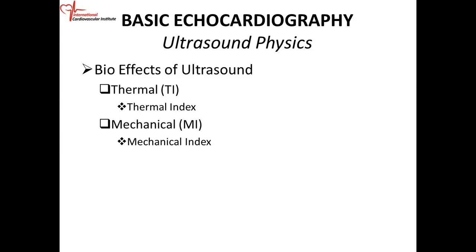That deals with heat production. And then when you say MI, it's mechanical index. It's the ability to form cavities. So the ultrasound can form cavities. And as a result of that, it can form bubbles, or it can burst bubbles. Okay?